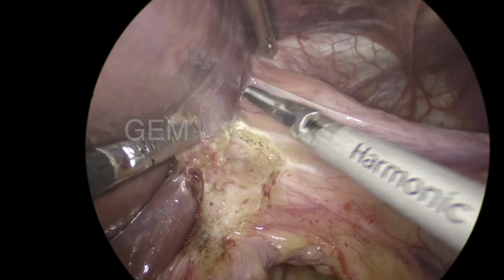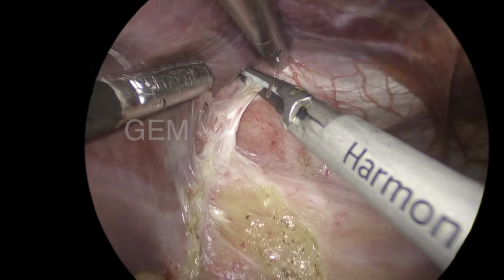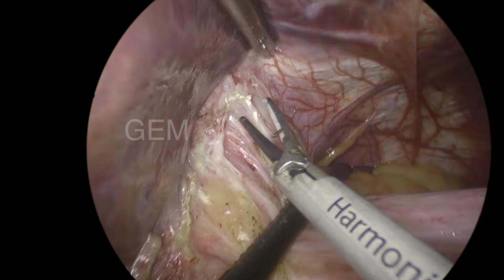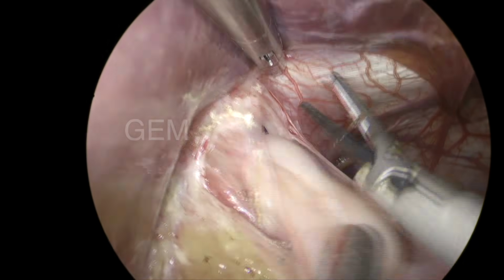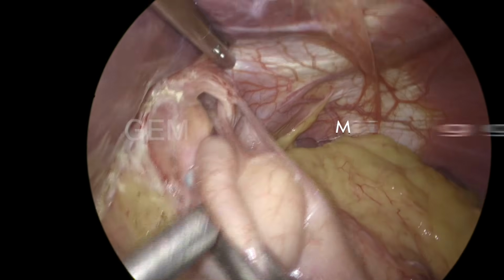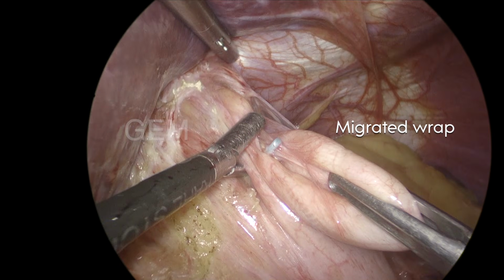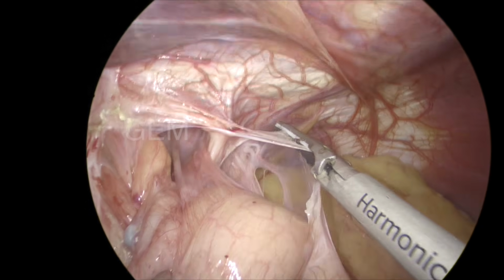So I started as usual from the left side. I released the adhesions of the liver from the previously dissected area. That is considered very important. In this case, I could see the free lying stomach inside, so I am trying to take out the stomach. That is basically a migrated wrap. You can see the suture. So that is a migrated wrap.